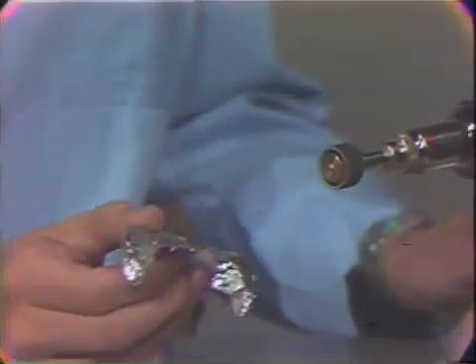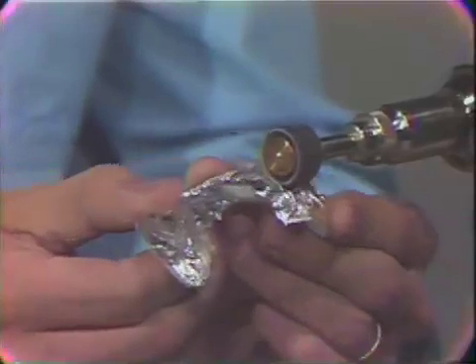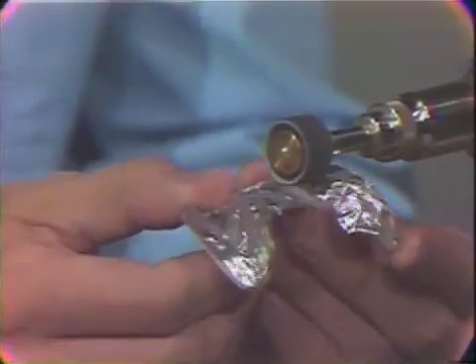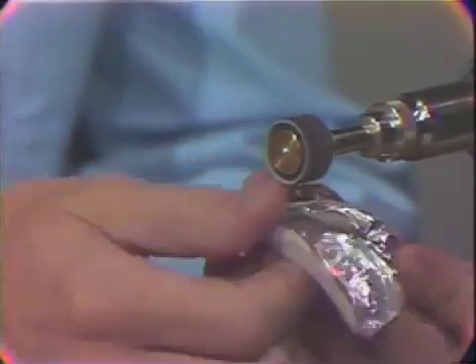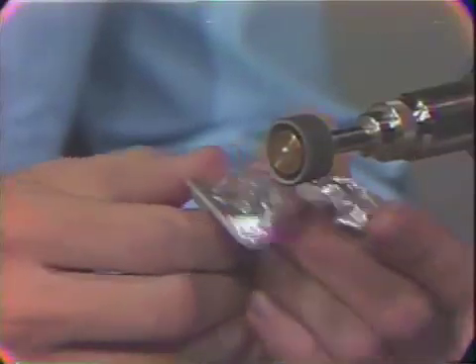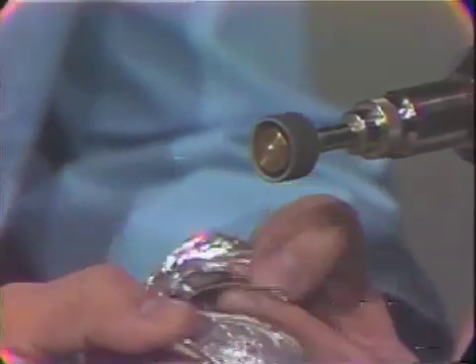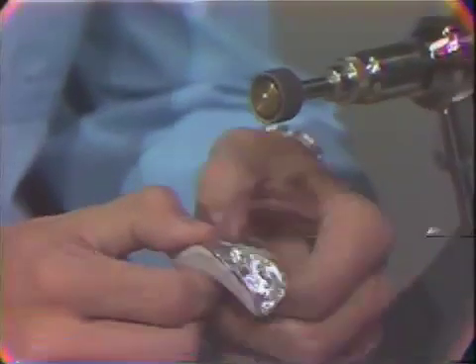The tin foil and the rubber are eliminated from the periphery using the lathe-mounted arbor band. The band will cut both the aluminum foil and the rubber and create a smooth and clean junction between the stabilizing material and the periphery of the acrylic resin material.